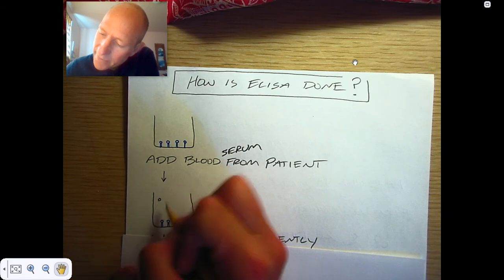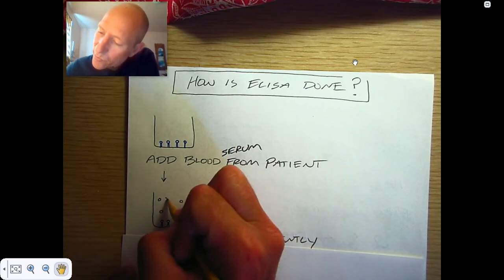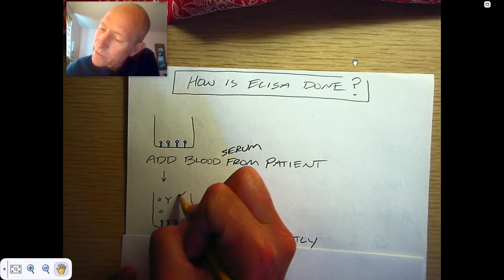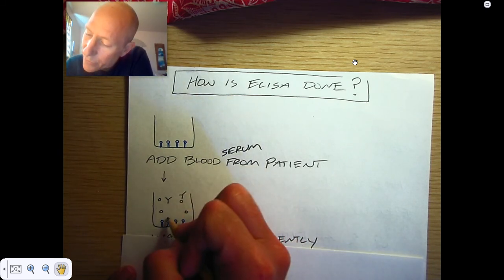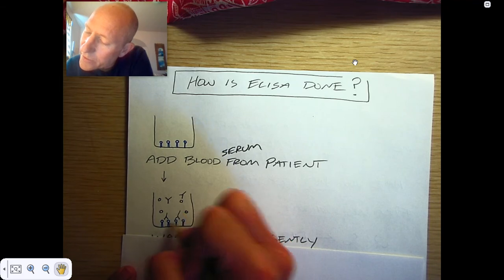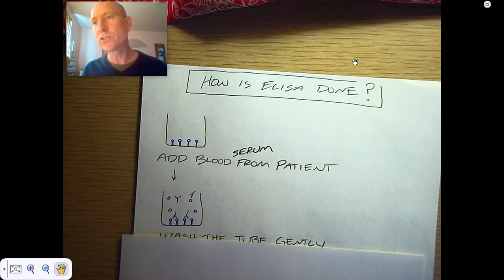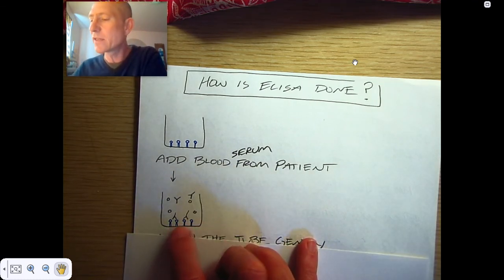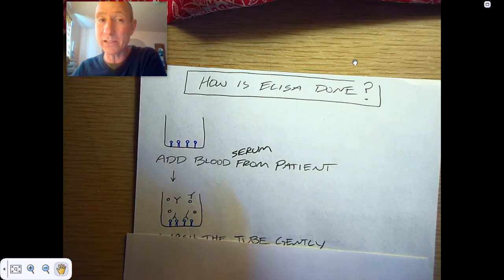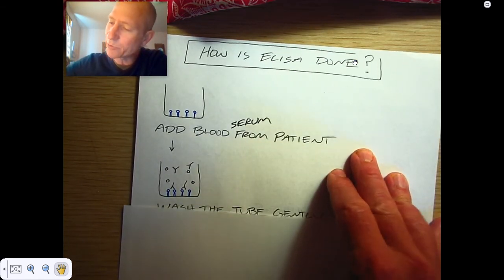And in that serum, there's all kinds of stuff. There's platelets in there, which we can symbolize like this. And there's random antibodies in there, which we can symbolize like this. And if the patient has had coronavirus, then they're going to have antibodies that stick to this spike protein right here. And the reason why is because that patient will have had an immune response to the virus. And in that immune response, they will have produced bazillions of antibodies that bind to the spike protein and label it as a bad guy. And incidentally, that's how you cure yourself of viruses. It takes a while, though. It takes a couple of weeks.